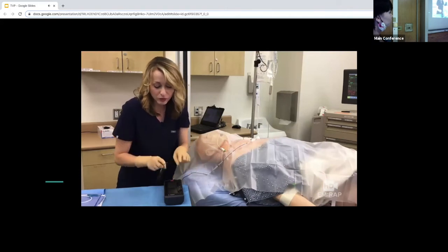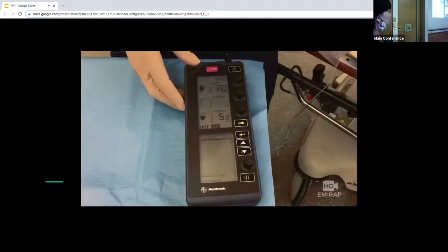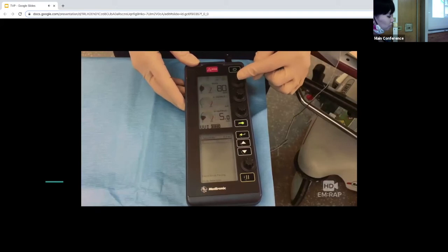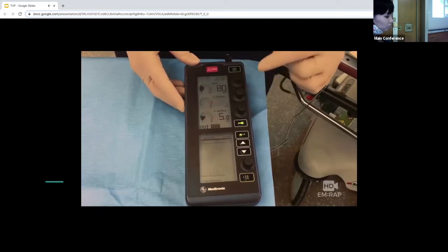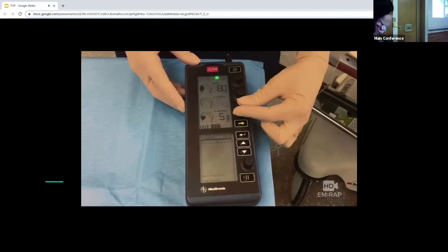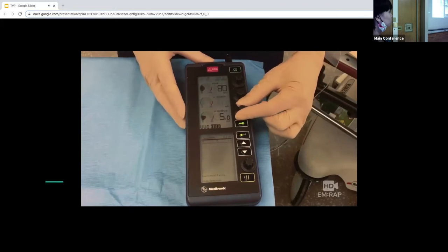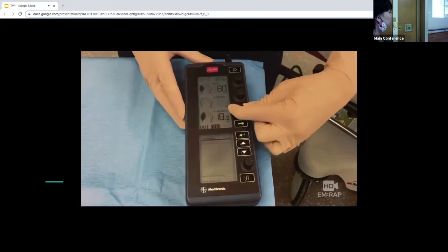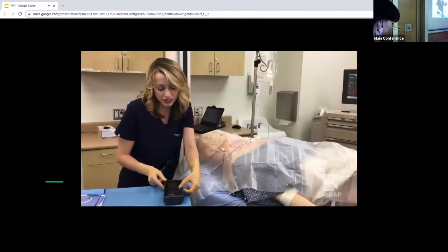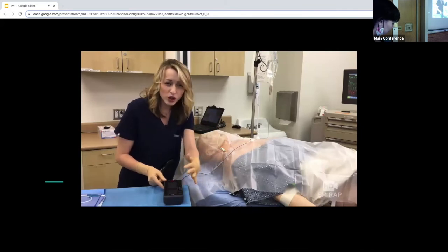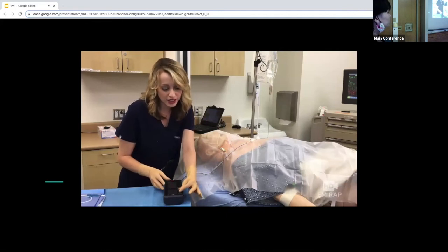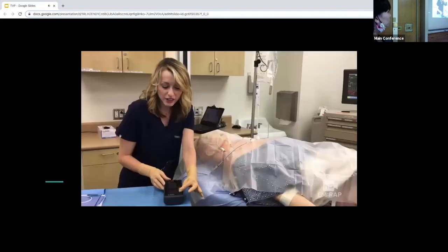Have the assistant turn on the pacing generator. The rate on this one is set to 80 — it's okay to go slower since their intrinsic rate will be much slower than that. We don't have to pace the atrium; we just have to pace the ventricle. This generator has options for both, but we're just pacing the ventricle. I have the output set at 5 milliamps — you can adjust that higher if needed. You can also change the sensitivity, which is set at 3. If you're troubleshooting and it's picking up some intrinsic rate, you can turn sensitivity down to zero. We'll leave it at 3 for now.